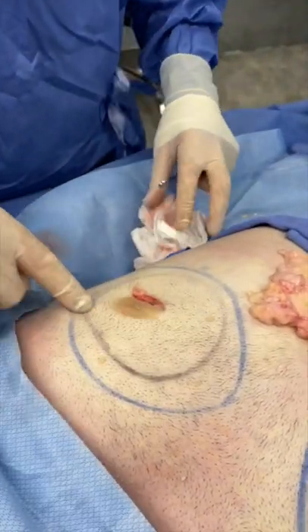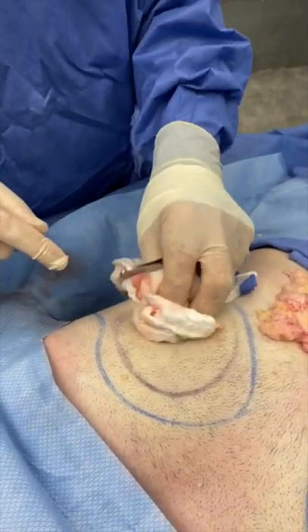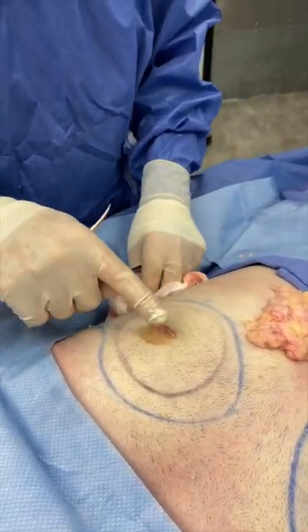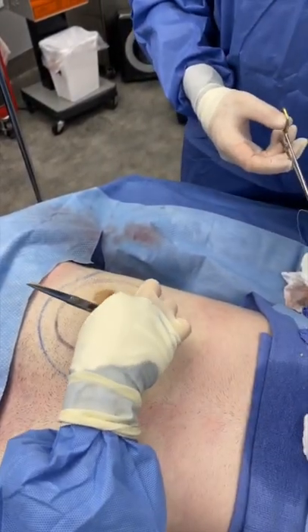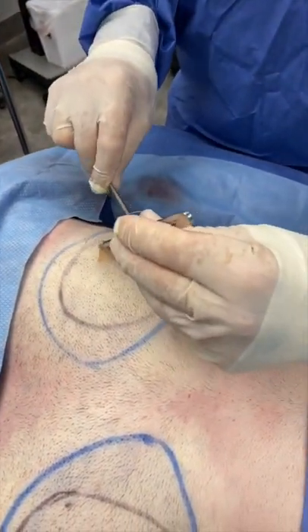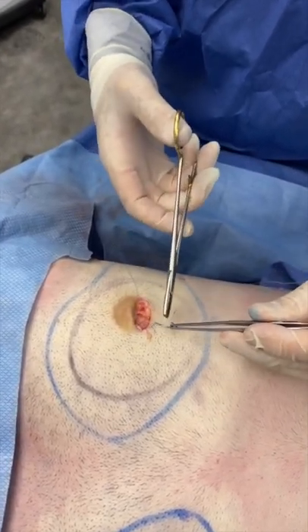This is the pectoralis major border right through here. I'm going to use the internal flap now to reconstitute a layer of tissue so that there's no depression at the nipple-areola complex. The purpose of the flap is to reconstitute a layer of normal subcutaneous tissue so there's no adherence of the overlying skin to the underlying muscle and fascia.